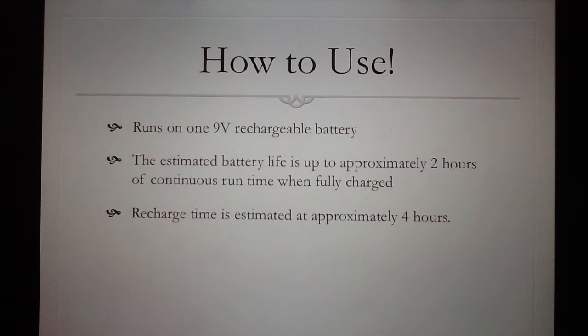It works by running on a 9-volt rechargeable battery. It has about 2 hours of battery life when fully charged, and the estimated recharge time is about 4 hours.